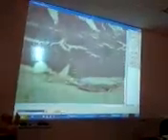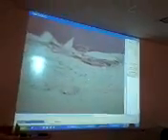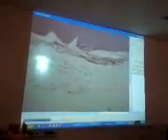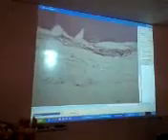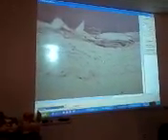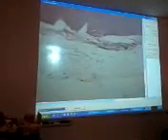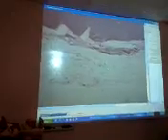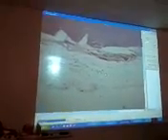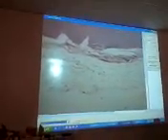And then if I get beyond the long layer, I'm into a much thicker, this is not serosa officially, this is actually adventitia. So remember the difference between an adventitia and a serosa is what? This is officially not serosa, it really should be listed as adventitia. I don't know if it has this on here. No, it's in the esophagus and the large intestine. Yeah, large intestine and the esophagus. Yeah, it's not a peritoneal boundary.